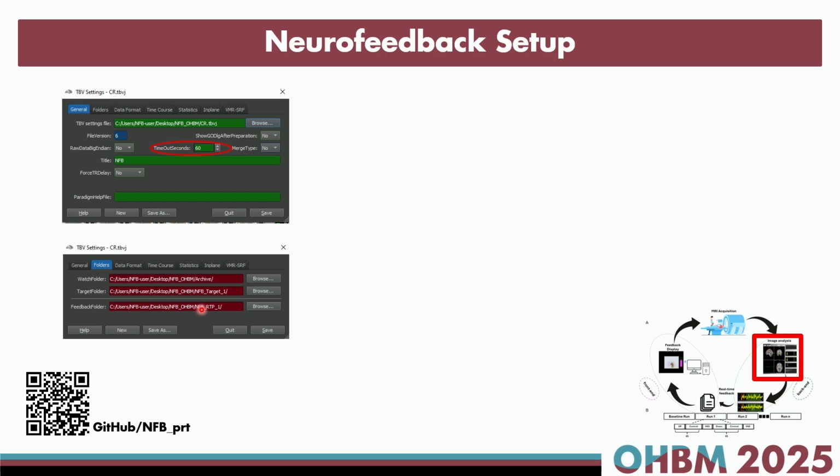What do they include? They include activations, percent signal change of your target region and your confound region separately. And it's the job of your script to regress out the percent signal change of your confound region from your target region. So you need to keep in mind to select the right folder for your RTP file.